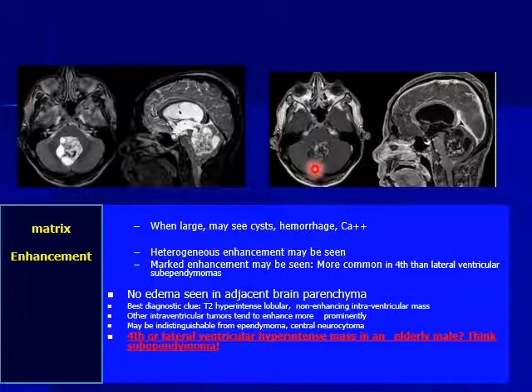Of course, he will take the tumor out of the brain and send it to histopathology. So it is very important to know that your main role is the pre-surgical planning and to tell that it is a tumor. And if it is very characteristic, you can put a spot diagnosis. Or if you are not that sure, it is not shame at all to put a narrow list of differential diagnoses that can help the clinician or the pathologist in their further work.